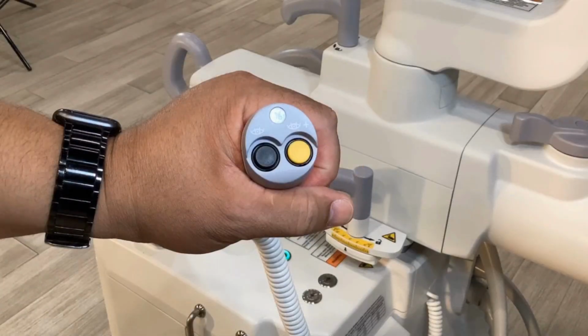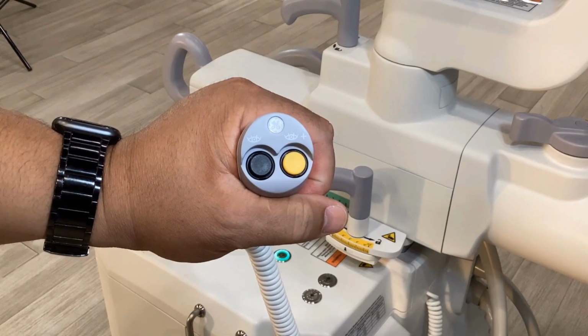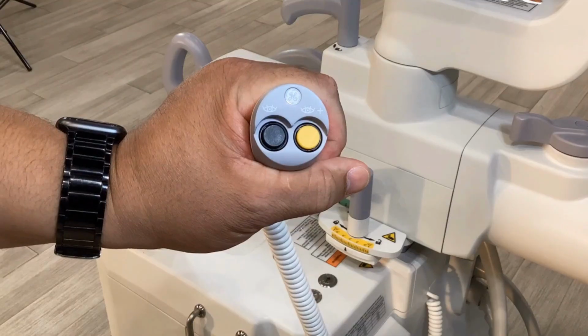The Handswitch. Press the left black button labeled with the eyeball to produce normal fluoroscopic images. Press the right yellow button labeled Eyeball Plus to produce high-level fluoro or digital spot images.